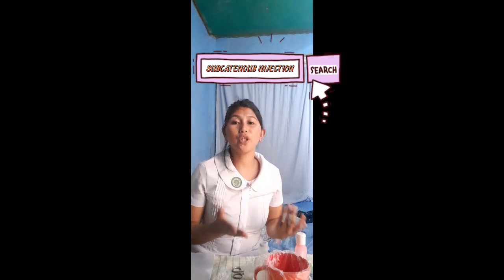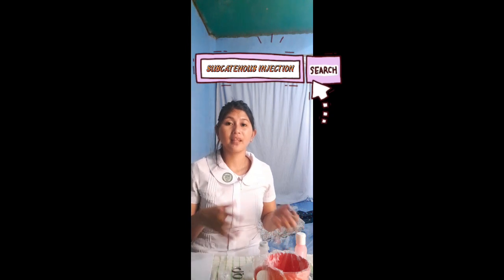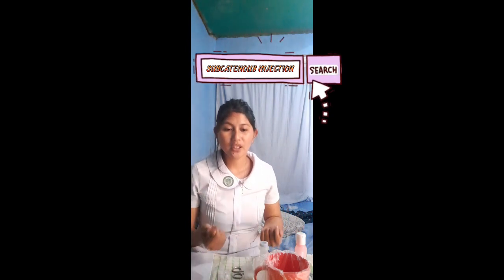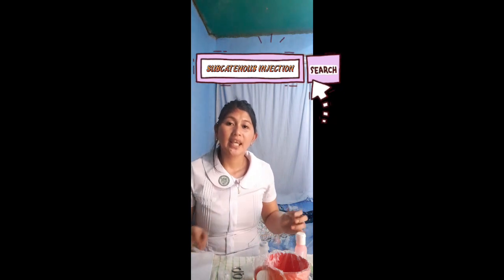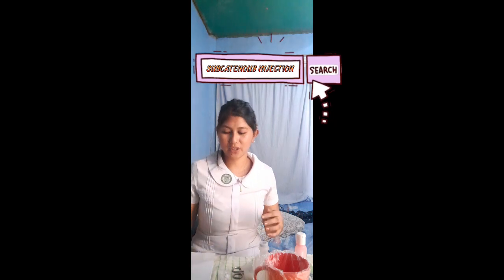After that, I am going to prepare all my equipment. So I have here all of my equipment, including the insulin syringe. Before that, I will review the medication ordered by the physician.